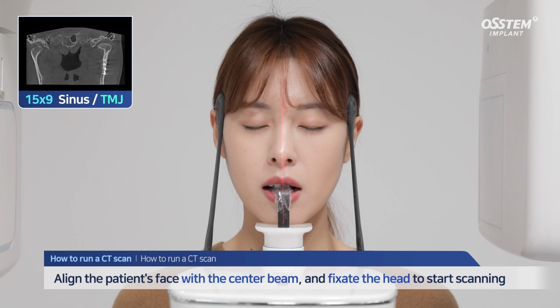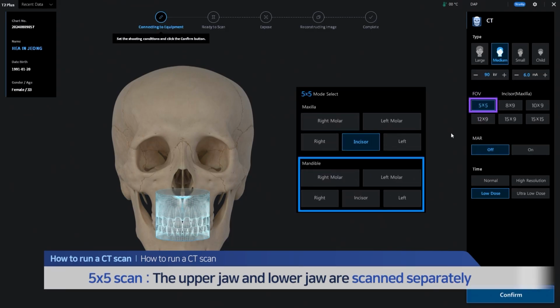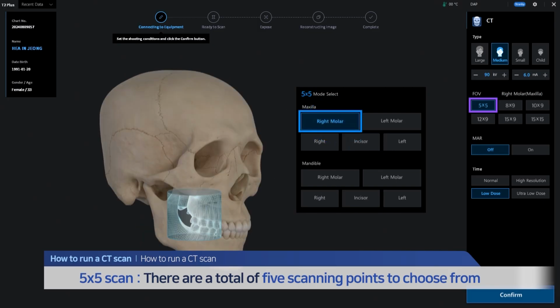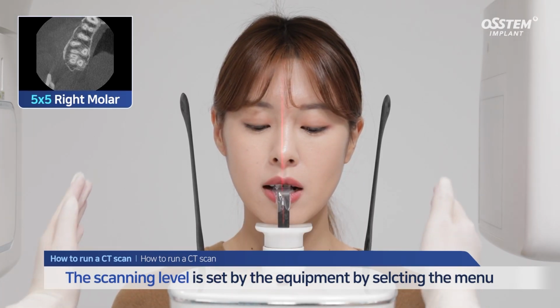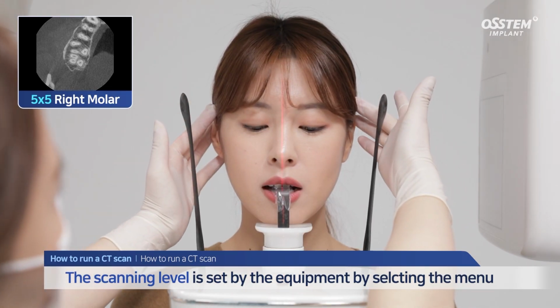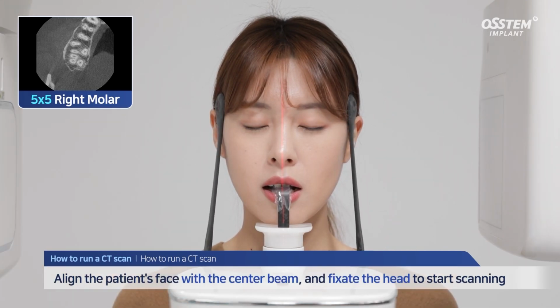With 5 by 5, you can separate the maxilla and the mandible and choose one of the 5 points for scanning. For 5 by 5, the scanning level is set by the equipment by default when selecting the menu. Align the patient's face with the center beam, then fixate the head to start scanning. Fine-tuning of the teeth position is not provided by the T2+.